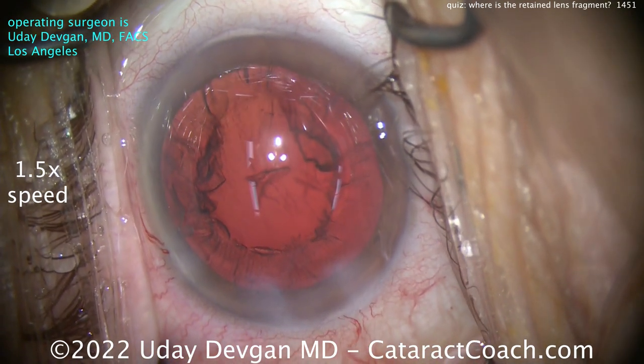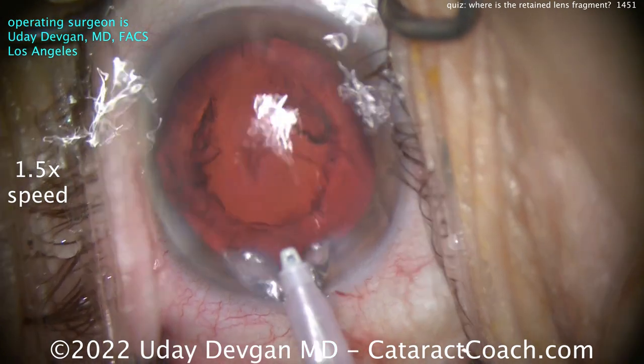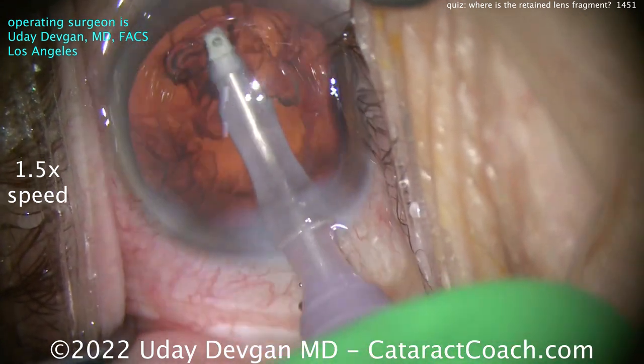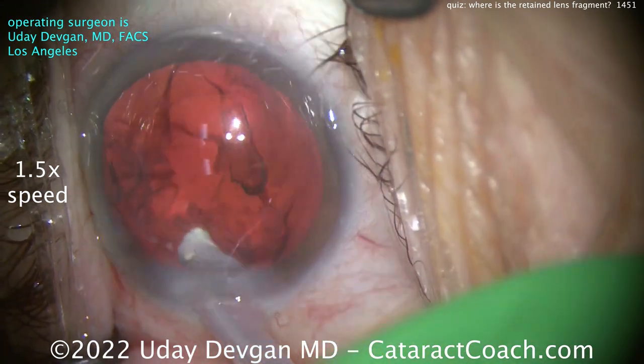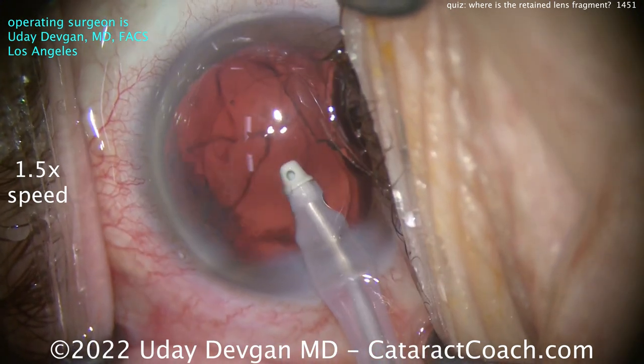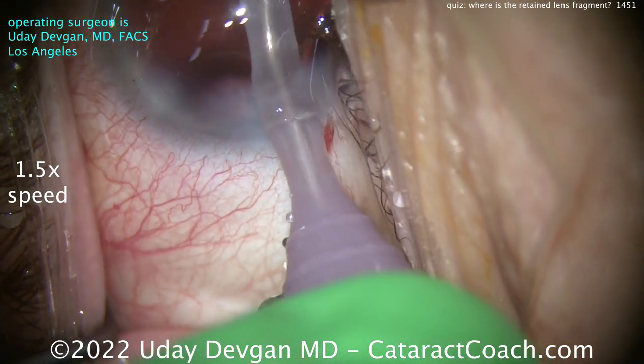Maybe you think it's during the cortex removal. So far it looks pretty good — maybe one little piece, but I don't see any nuclear fragments. Let's put the I/A probe in the eye, aspirate down all the cortex. I've emphasized the red reflex in post-production to really make it bright so you can clearly see.